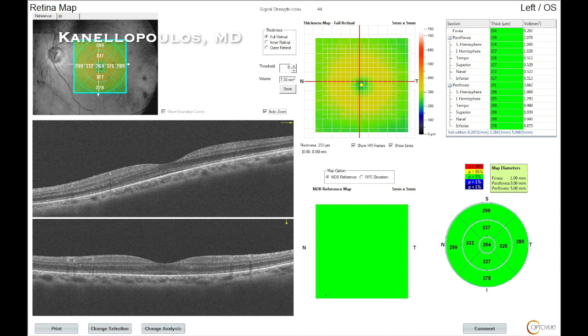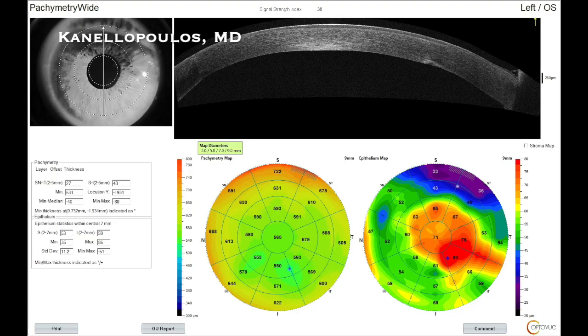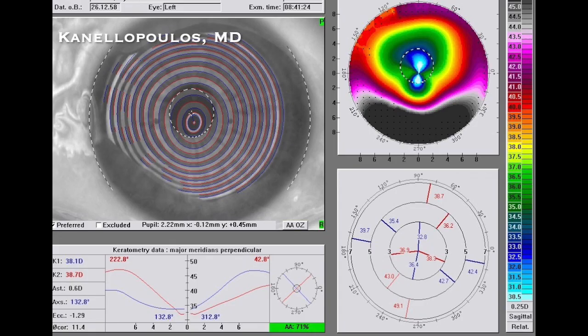And we're going to go to the endothelial cell density. There is some polymegethism here, although the overall endothelial cell count is relatively good. Very bizarre epithelial remodeling in this RK incision patient on the anterior segment OCT by OptoView, and our placido topography shows significant astigmatism against the rule, with a slight angle kappa.